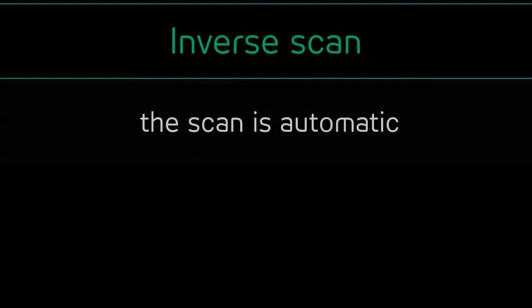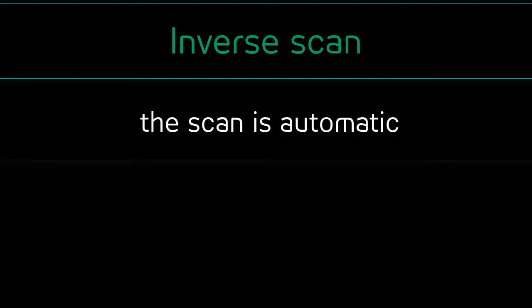Inverse scanning is set to an automatic scan speed as it's selected within the option settings.